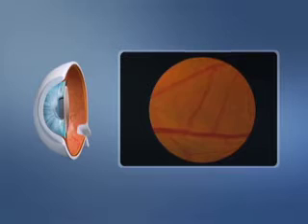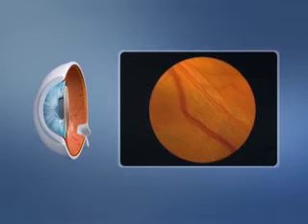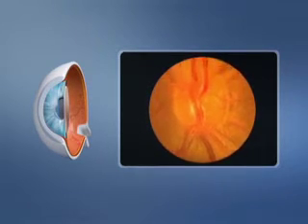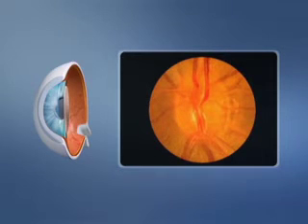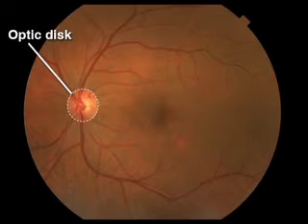You will be able to observe only a small area of the retina in the viewing window. Tilt the ophthalmoscope to visualize different areas. Find and follow a vessel as it increases in caliber, going back to its origin at the optic disc. The optic disc is located about 15 degrees nasal to the center of the retina and should appear yellowish-orange.